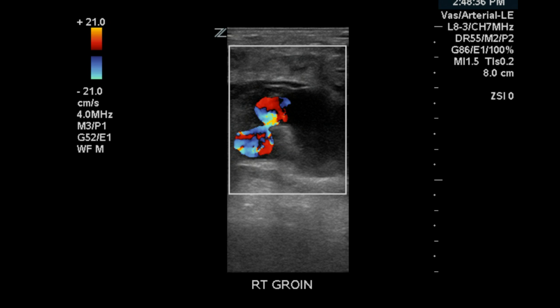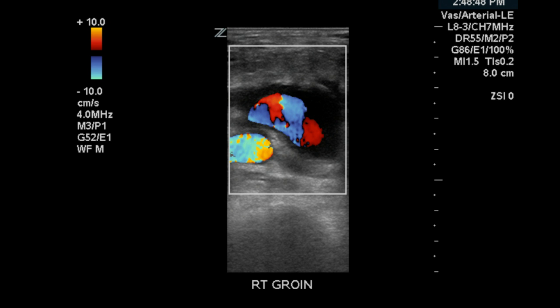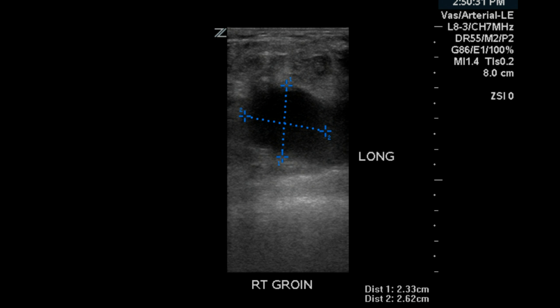Here's an image of the neck and the classic swirling red and blue color pattern of a pseudoaneurysm. Now, it's important to take diameter measurements for two reasons: for the interpreting physician's information to determine how large of an area he may have to inject, and for follow-up studies to determine if the area has gotten either larger or smaller.